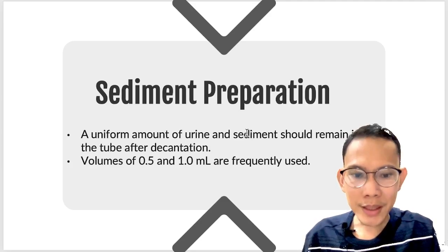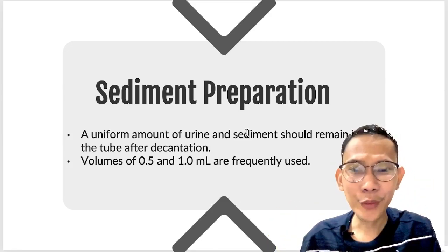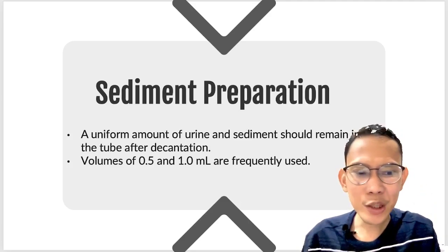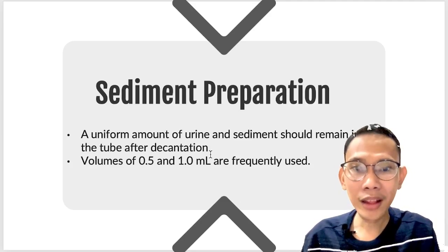So, some systems provide a pipette for this purpose. This is the most ideal, but we do not have this kind of commercial system. The pipettes, yung ginagamit nila na pipettes, are used for sediment resuspension and transferring of your specimen to your slide. Okay? The sediment must be thoroughly resuspended by gentle agitation.